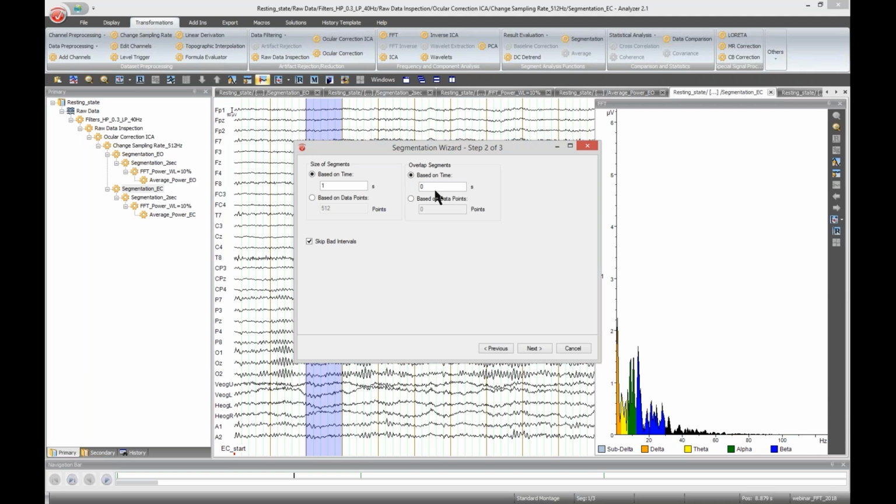Of course, after performing FFT, because if you already average and then apply FFT, you will lose the frequency content of your signal. By averaging, you will cancel them out and you will not get the true spectral content. So I would advise to first segment the data to fulfill this quasi-stationarity requirement for better interpretation of your result, and then average it. Okay, I hope that answers your question. I will move on to the next question.